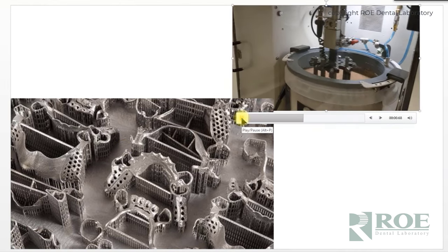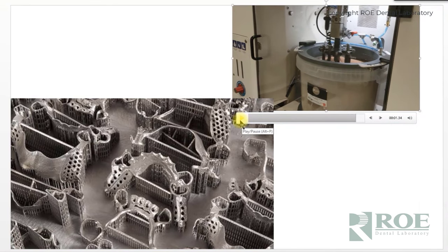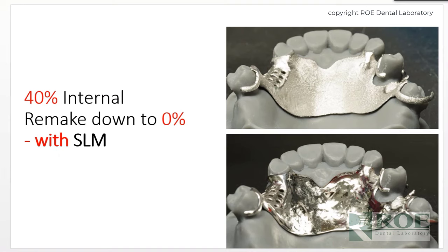This is what the plate looks like — all these partials lined up perfectly, supported by little struts underneath each part of the partial. Once finished, it goes into a polishing machine that has eight little arms. You bolt a partial onto each arm and the machine goes around in a circle for about an hour, polishing the partial until it's as smooth as can be. Going from a 40 percent internal remake rate down to nearly zero — it's really rare when a partial comes out and doesn't fit perfectly to the model. Investing in this expensive technology was totally worth it.